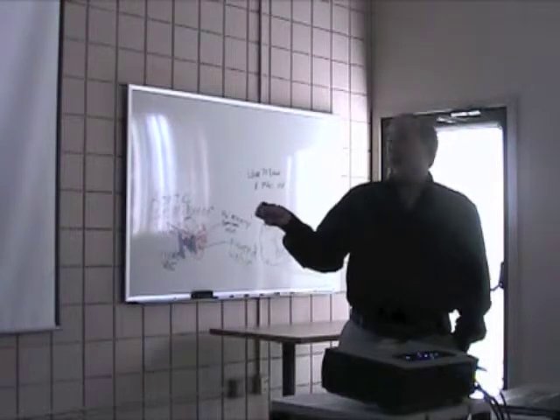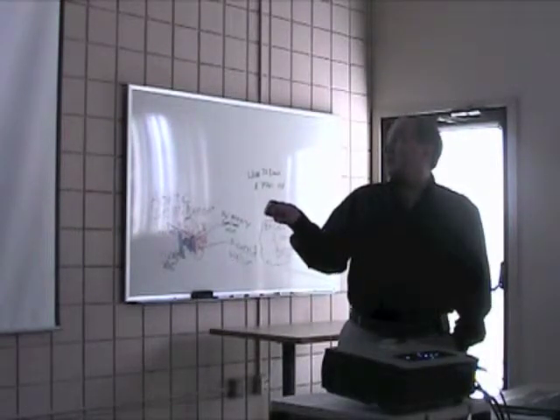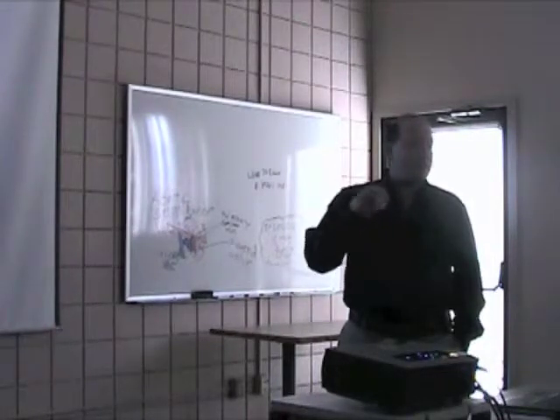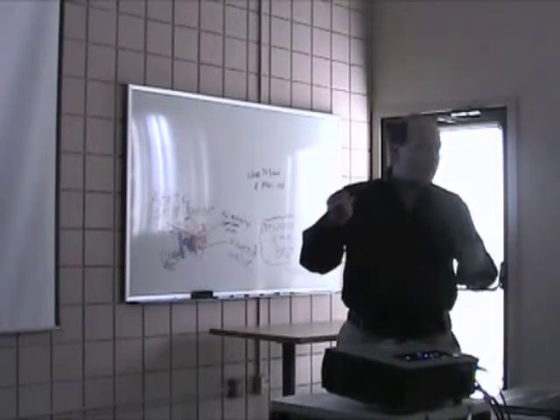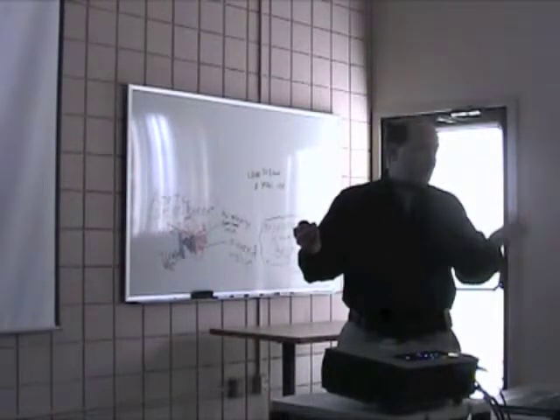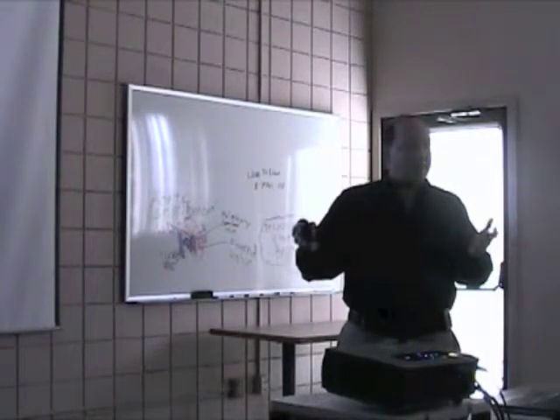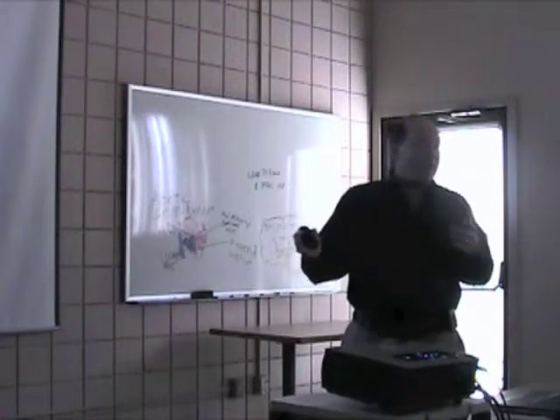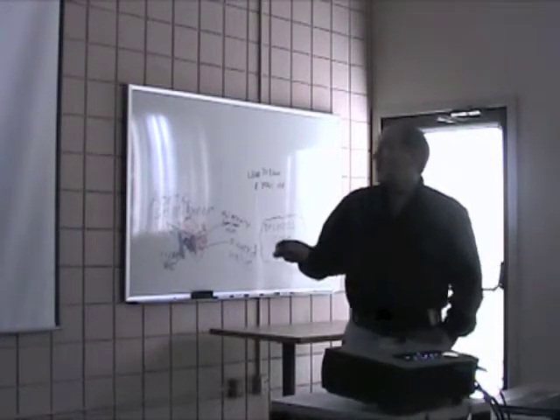When we're choosing what valve to put in, we think a lot about patient factors, and a lot of it has to do with what the patient wants. When I talk to somebody about a valve replacement, I go through all the issues about the mechanical valve and the anticoagulation, and the biological valve, or the non-mechanical valve, and wearing out. And so I let them make the decision.